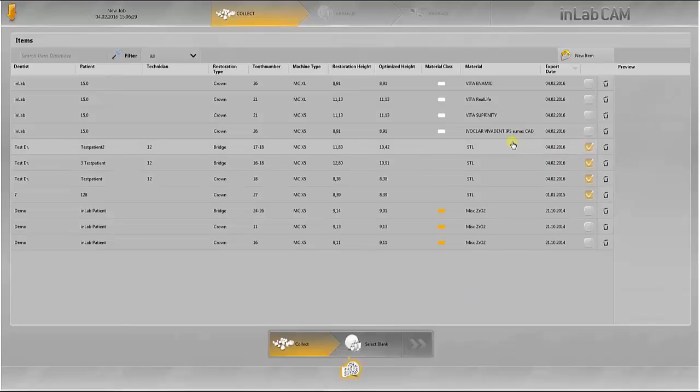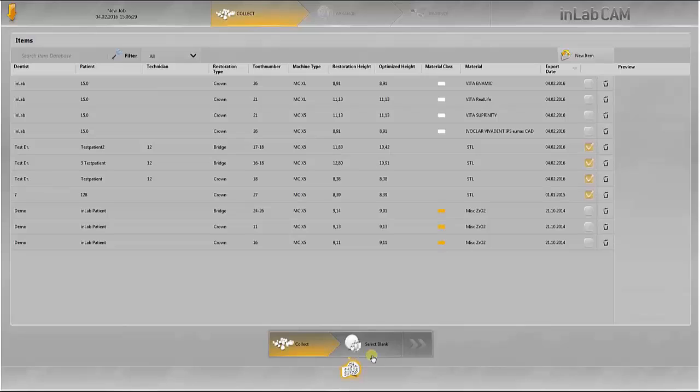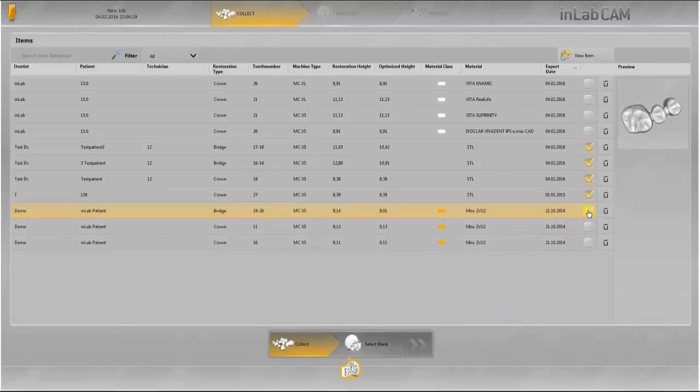The datasets which have just been imported are already selected. In addition to the STL files, an InLab dataset is now added before the material is selected.